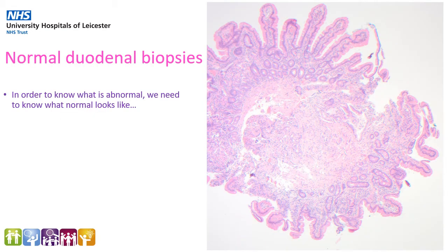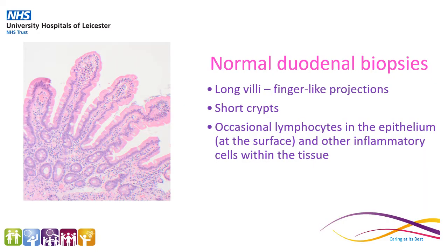In order to know what abnormal tissue looks like, first we need to know what the normal tissue looks like, and here we have a picture of a normal duodenal biopsy. Looking at this on higher power, we can see that the duodenum has these long villi, which are finger-like projections which extend into the lumen of the duodenum, increasing the surface area and improving absorption of nutrients from the material passing through. It has these short crypts at the bottom, and then in the epithelium there are these small blue dots, which are lymphocytes, a type of white blood cell.